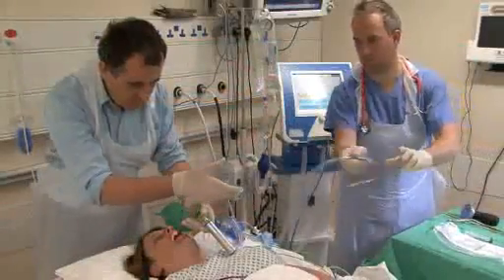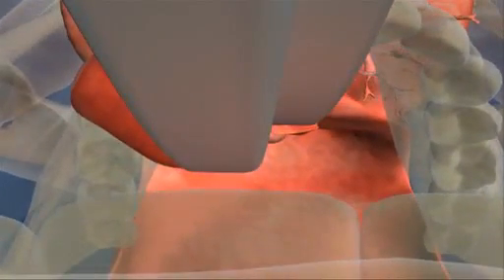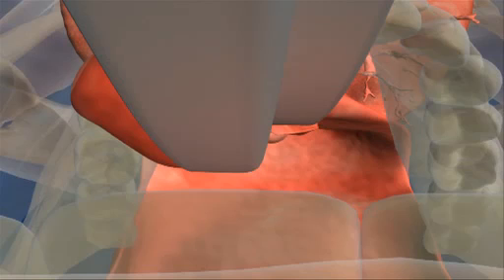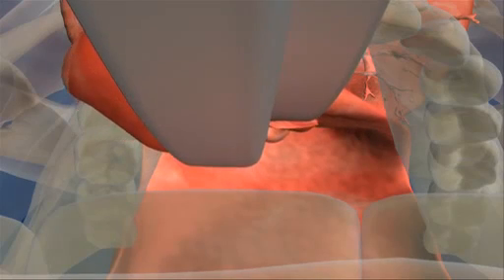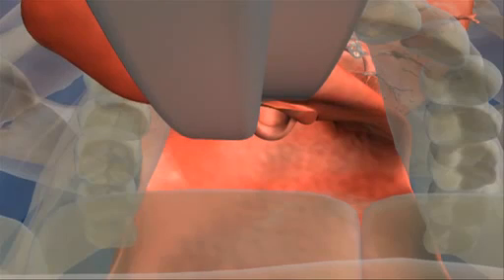The laryngoscope should be gently introduced through the open mouth and the blade aimed towards the right-hand corner of the mouth. Advance the tip of the laryngoscope blade towards the posterior pharyngeal wall, sweeping the tongue to the left in the process. Position the tip of the blade in the vallecula and lift the laryngoscope upwards in line with the handle to lift the epiglottis. Expose the glottis and enable visualization of the vocal cords.